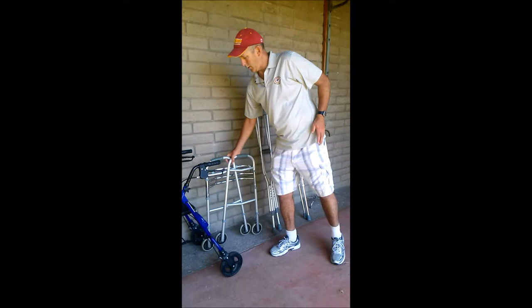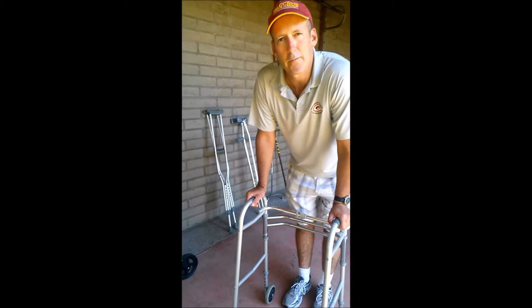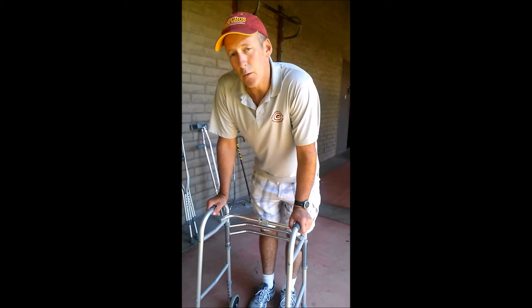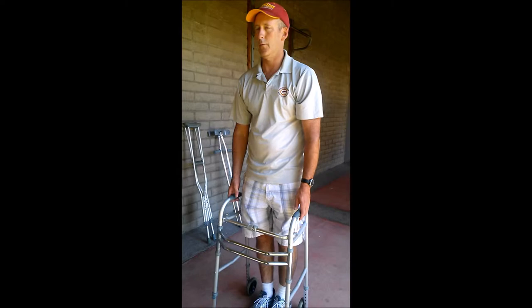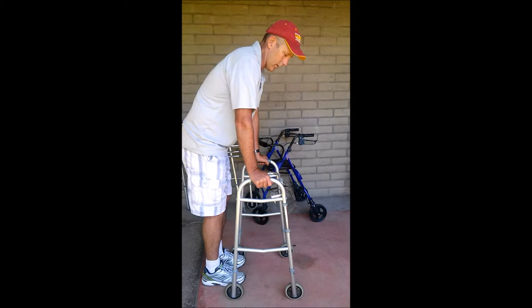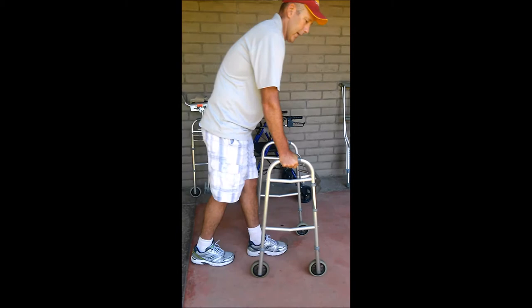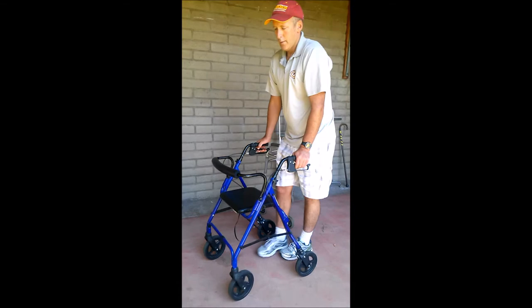Probably the next step up would be using a front wheel walker. This one is actually a four-wheel walker, so there are a few different basic types of walker devices. The most basic will have no wheels - a pickup walker where you pick it up and move into it - slowest but most stable. The next would be a front wheel walker with two front wheels that you can slide around. Then we get to four-wheel walkers, which are the most mobile but the least stable.